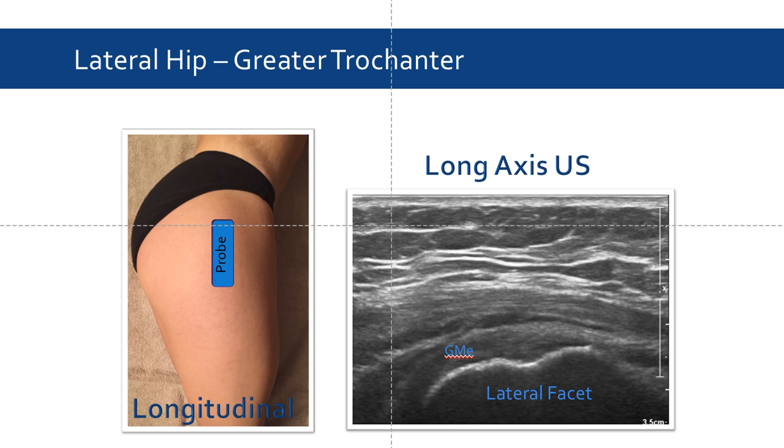With that in mind, we can move away from the transverse probe position at the anterior and move the probe superiorly and laterally, rotating the indicator dot towards the head. This will give us a view of the greater trochanter. In this view, we can appreciate the lateral facet, as well as the tendinous gluteus medius insertion.